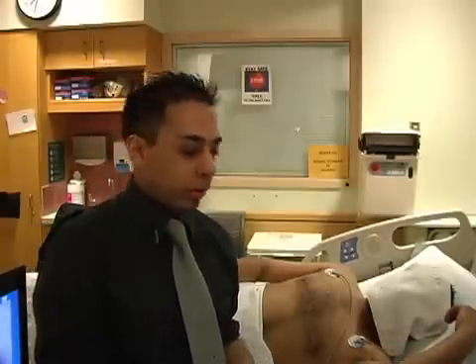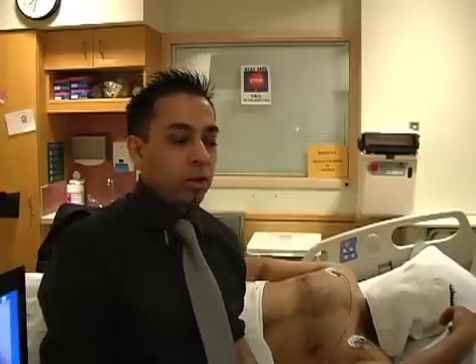I'm Vimal Pedaglia, a third year cardiology fellow. Today we'll be looking at three standard views of point-of-care ultrasound in terms of echocardiography, assessing for ejection fraction.